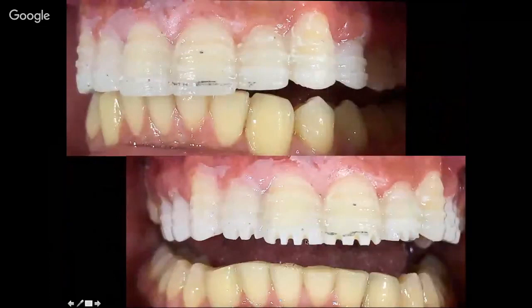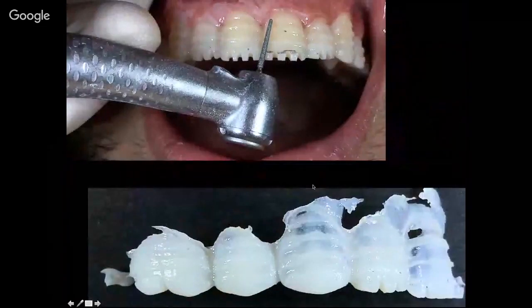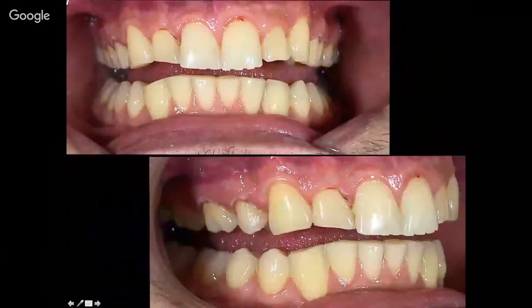These are the grooves, incisal grooves, and 3 other grooves above this line. So we removed the temporary, and you can see that we did not touch the length of the teeth, even a little bit on the margins, on the central, on the incisal edge. On the other teeth, we didn't touch the teeth. So this is a guided, really non-invasive, little to no prep technique.